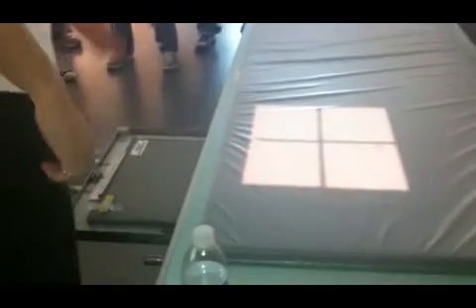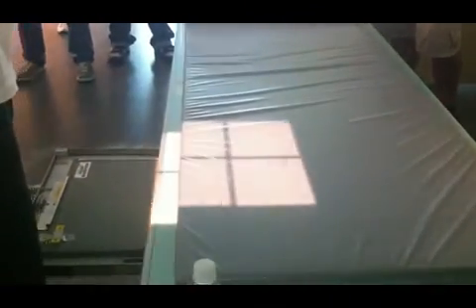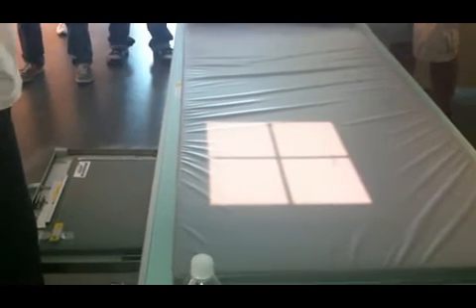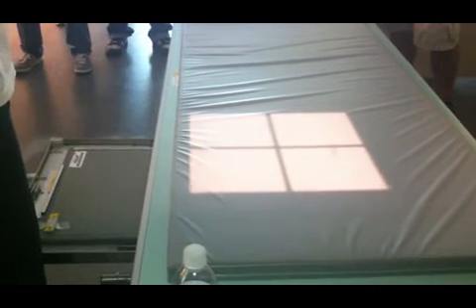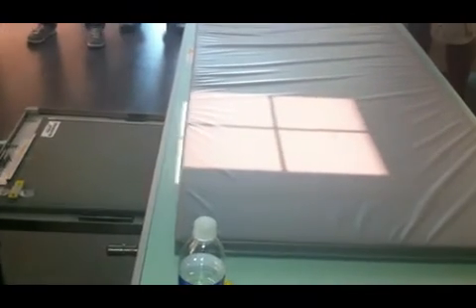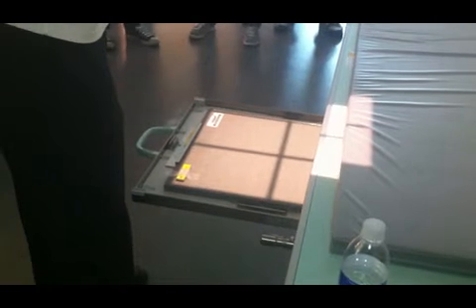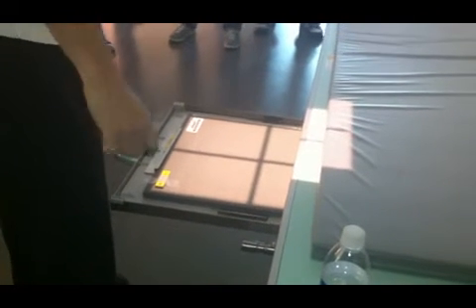So center, front to back, or side to side, and the center forward, side front to back. You want to bring this across, make sure your collimation is set at 14 by 17. You can do that. Just bring this halfway out. Bring this over. That's what you have to do.